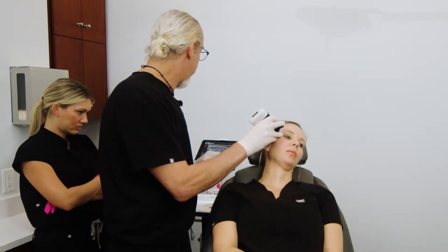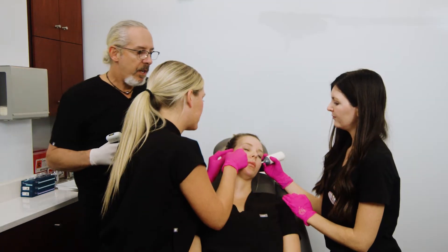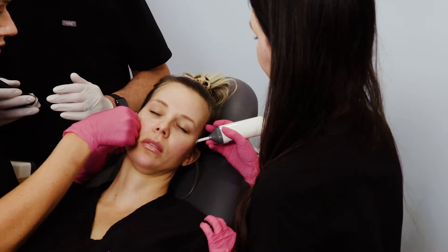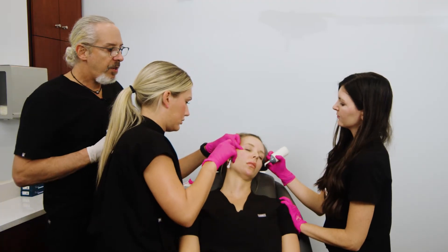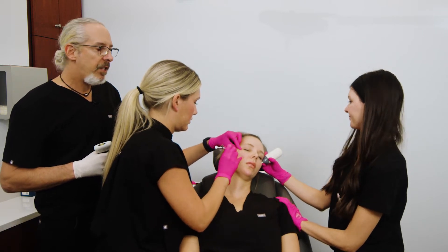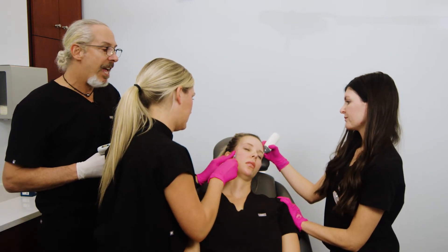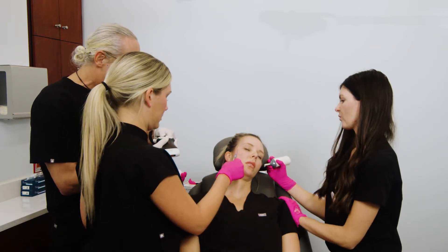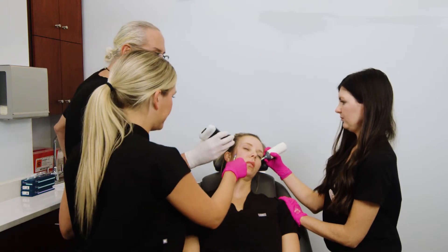Let's start the injection — I'm going to use the ultrasound to confirm placement in that interfacial plane. We're doing a pilot hole. This is going to be a 23-gauge cannula, 50 millimeters, a soft-tipped cannula. She's going to insert it through the dermis and then pierce the SMAS to get into that interfacial plane. Do you see that pop? That pop confirms that we're below the SMAS, and now that interfacial plane should be a glide plane.